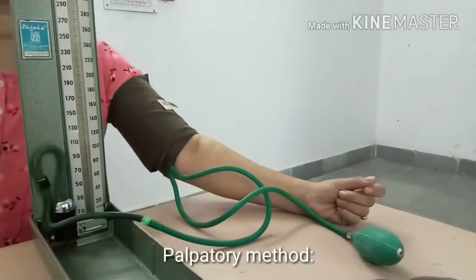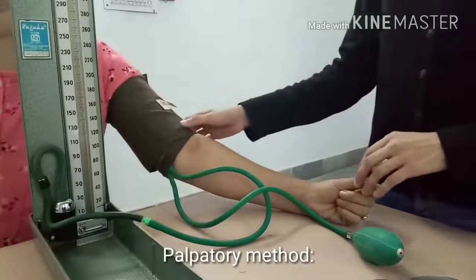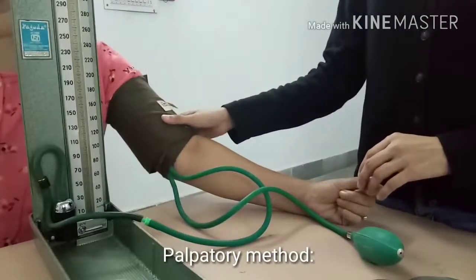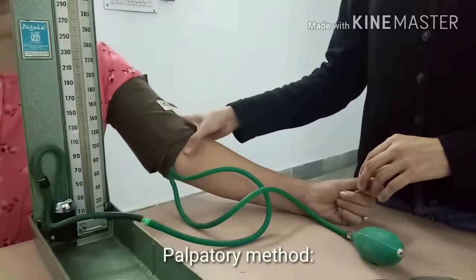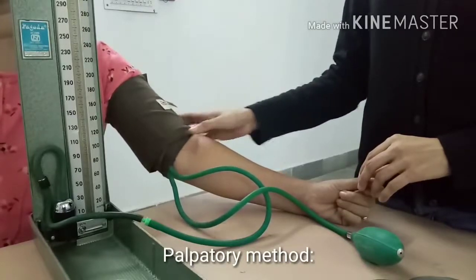Procedure: Apply the cuff to the arm with the middle of the cuff over the inner side of the arm with its lower edge 2 cm above the elbow. Now, starting with the palpatory method.